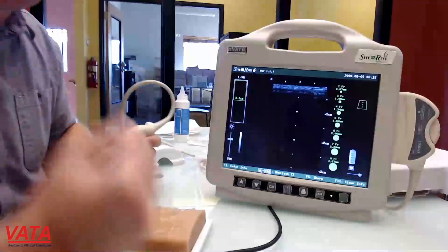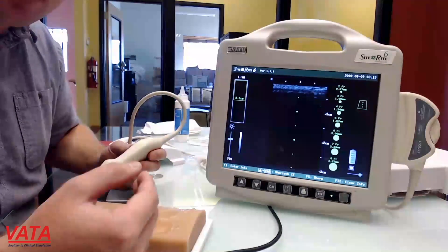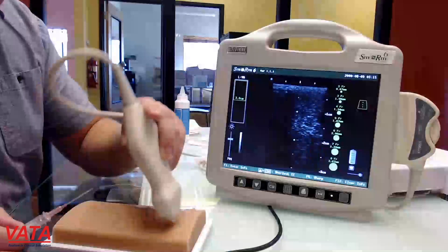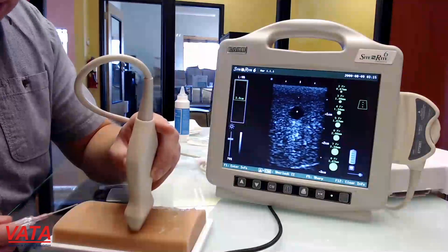These accesses aren't going to be super difficult — they aren't super small and they are straight. But it's really to practice that skill set. Let's go ahead and see how I can do accessing this one.